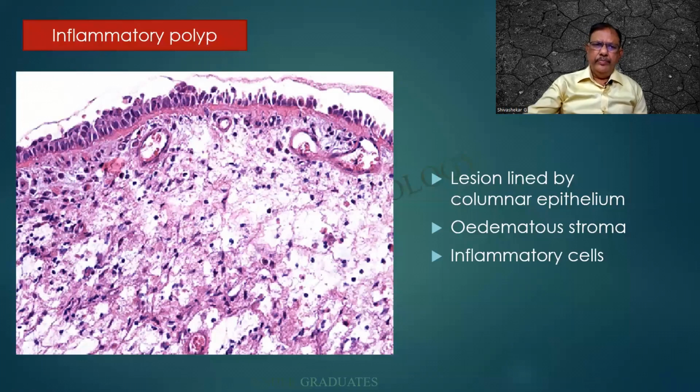Look at this slide. I find that there is a lining epithelium, which is composed of columnar cells. Sometimes I find that the cells may be piling up on each other. So we will call them pseudostratified columnar epithelium. The pink line that I'm seeing is the basement membrane and the underlying collagen. So the epithelium is well above the collagen that is there.